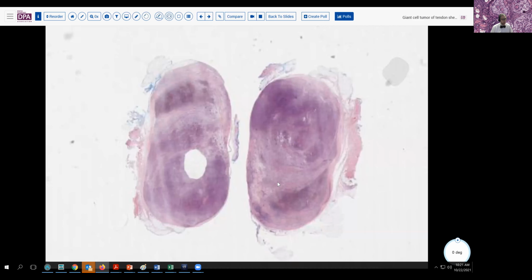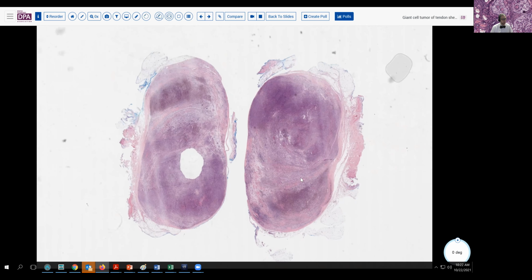So the lesion was resected. And here we see this nice rounded lesion, somewhat of a lobulated architecture, a few bands of collagen, and variable cellularity, some very densely cellular areas, as well as less cellular areas. We also get a sense for the staining characteristic in that you'll notice there's a little bit of gray brownish material in some of the areas of this tumor, less so in others.